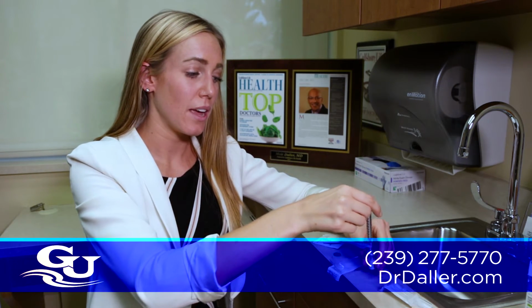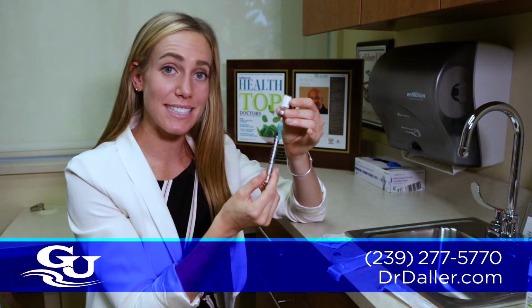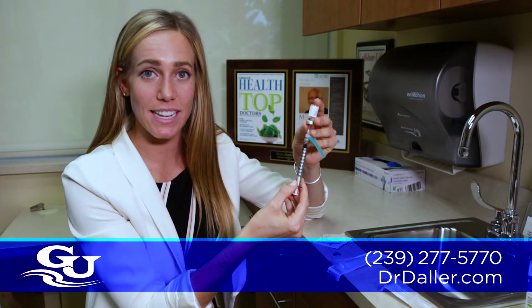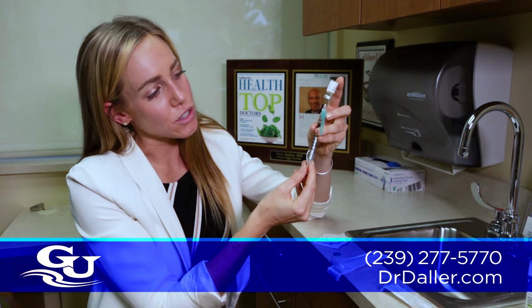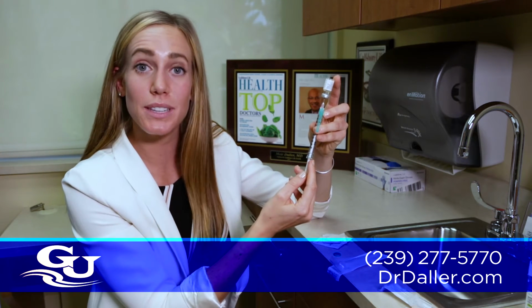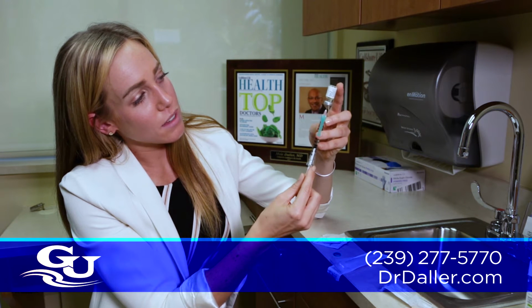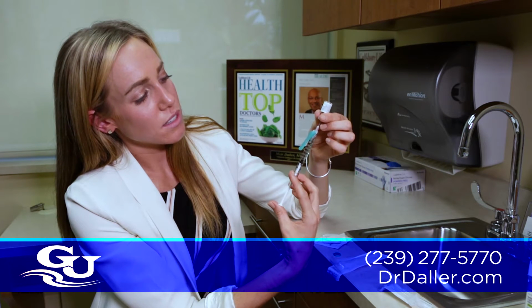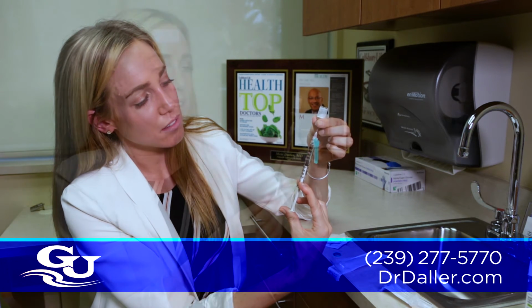Now what you want to do is turn your vial and syringe upside down, ensuring that the tip of the needle is still in the fluid that you want to aspirate. So now, since we're doing ½ of a cc, we're going to do the same thing that we did before. Pull back to the top of the plunger. You might want to do a little bit more right now. And there's air at the top. So we keep pulling back. And then inject until the top of that black plunger gets to ½ of a cc.